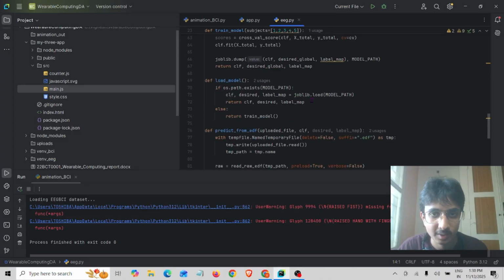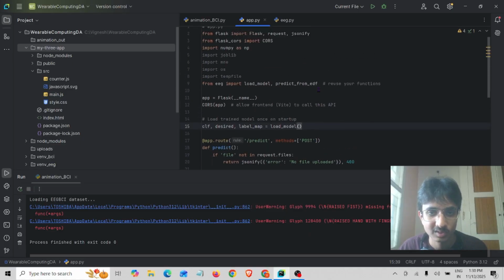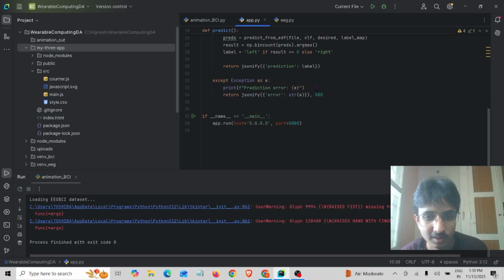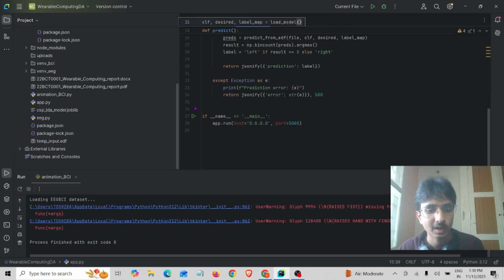After this, let me show you the Flask server, which is used as a web server for our Python ML model. This is the Flask server that I have created for this purpose. It is used to receive the EDF files and pass them on to a prediction server, that is the ML model. After training the ML model, that is EEG.py, we have saved the results into a joblib file, as you can see, CSP LDA joblib. This is the file which has the pre-trained weights of the model. And now let me show you by running the code.